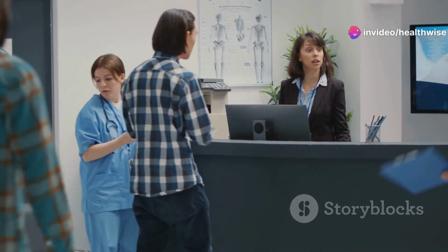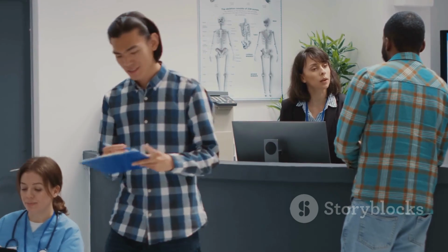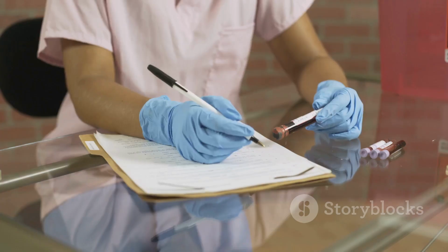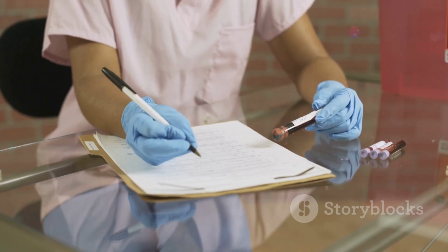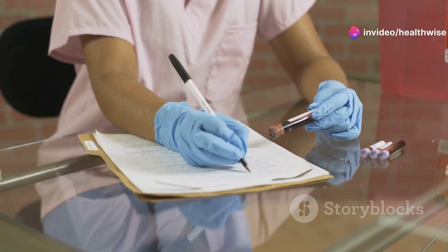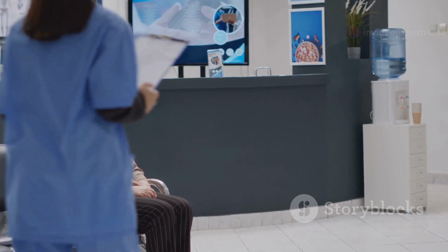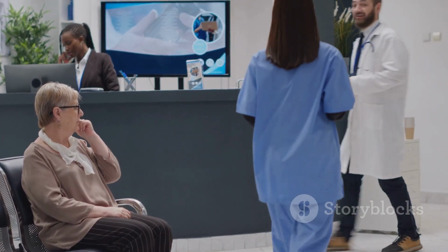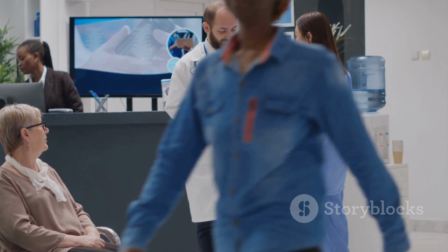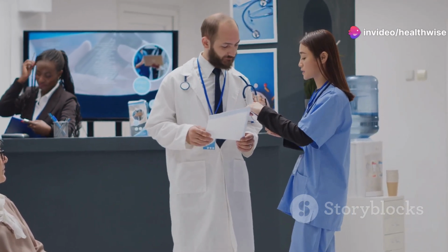When a patient arrives at the reception desk, the reception staff registers the patient and documents important identification and demographic data. This includes their registration or hospital number, rank or designation, name, age, unit or address, and the test to be conducted. The staff also checks the patient's entitlement using various identification methods like a family treatment card, unit certificate, individual identity card, or discharge documents.